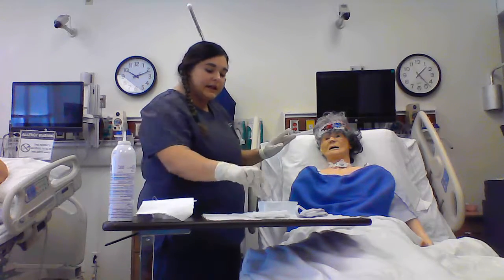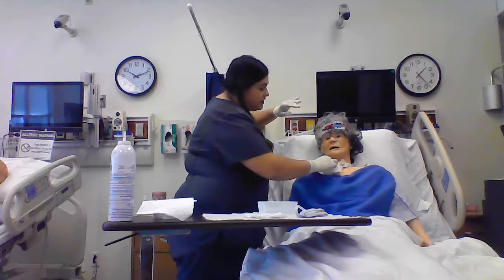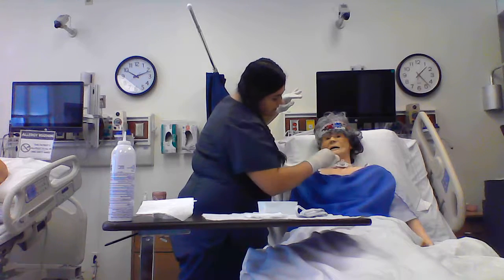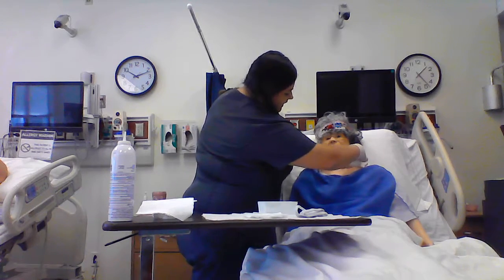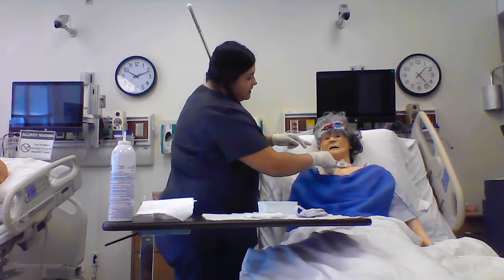Okay, and then I'm going to take a dry sponge here, and I'm going to dry my patient. Because you don't want to leave around this tracheostomy wet. It can introduce bacteria. It can cause skin breakdown.